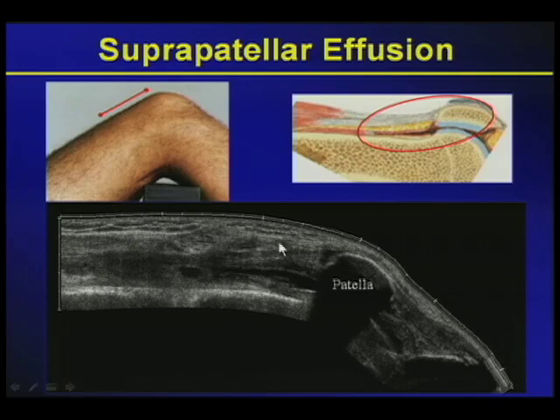In between the distal quadriceps tendon and the cortex of the femur, you'll notice that instead of just plain fluid, we now have some rind forming in an otherwise clearly anechoic fluid. Well, this rind represents chronic synovial proliferation and thickening of this lining in a patient with osteoarthrosis. And so, aside from characterizing the changes within the fluid of these patients, you also begin to appreciate the fact that you can detect synovial changes with ultrasound.